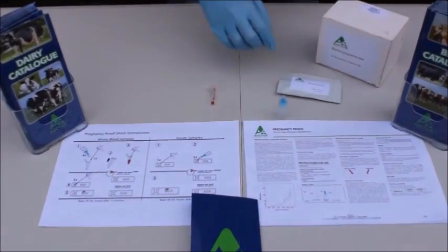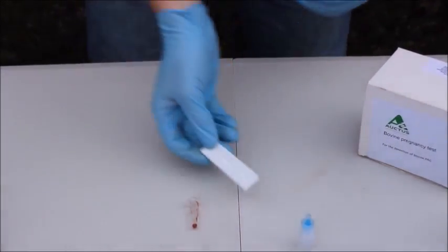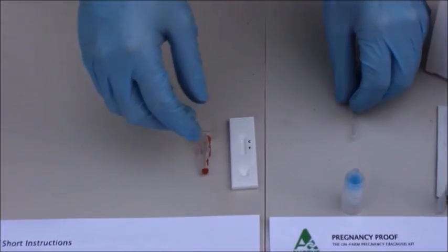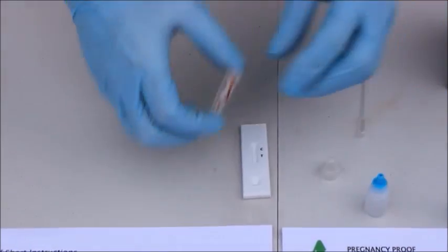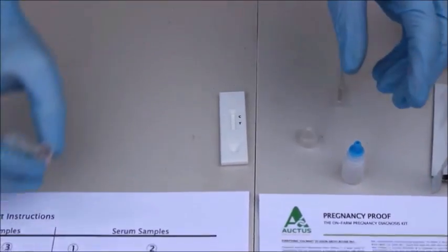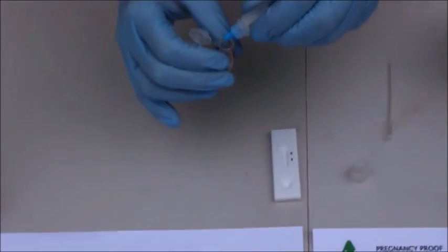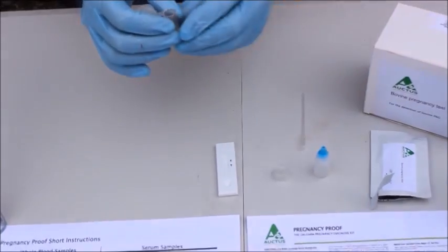Now we have the blood sample obtained. We keep the pouch sealed until we're ready to test the sample. We have the test cassette in place and now we need to add one drop of blood — as per the short instructions — as well as four drops of the reagent. The four drops are now added: one, two, three, four, and we can mix up the mixture.